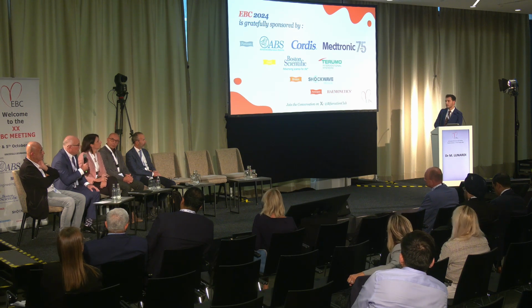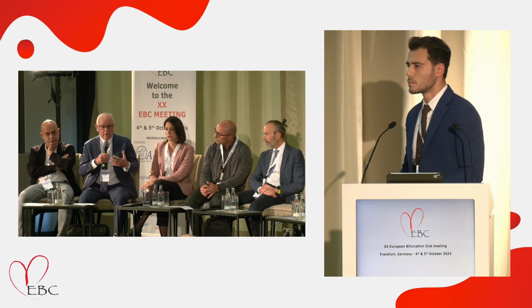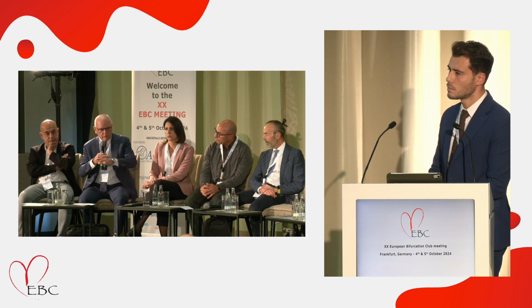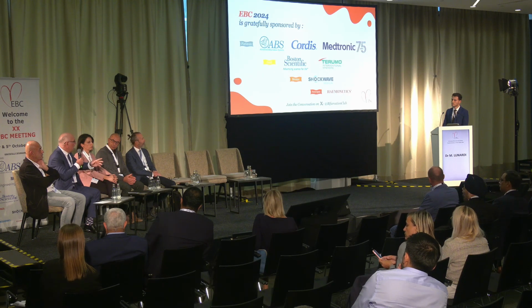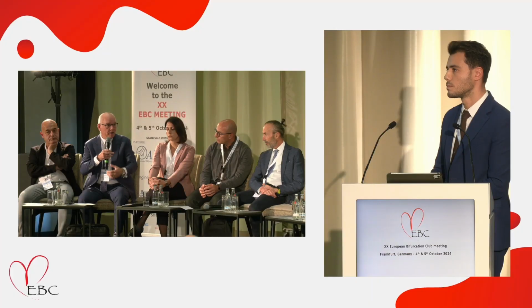Yep. So there's a lot of discussion, despite the bench data, pot side pot versus kiss, and we also know from the clinical data with studies, routine kissing versus no routine kissing, there's just mixed results. It can favour routine kissing, it can actually favour keeping it simple. Often if routine kissing is adverse, the penalty is the main vessel. And I think one of the reasons is it's incredibly elegant what you show is using the imaging, particularly to know that you're rewiring in the correct cell, and also obviously not going abluminal.